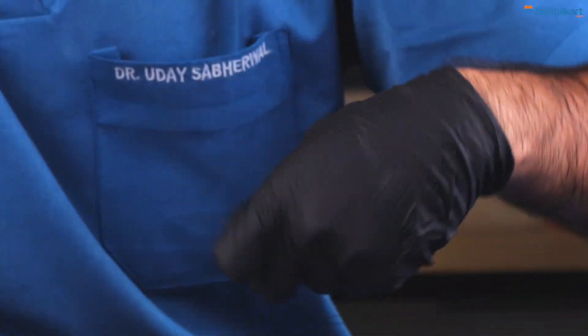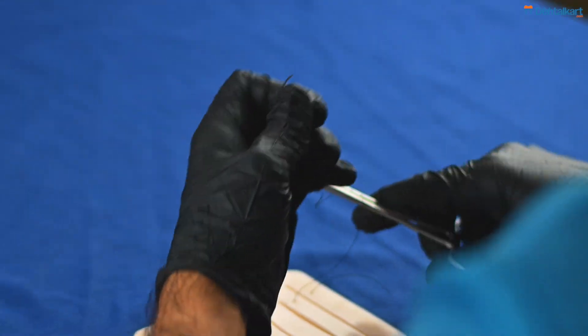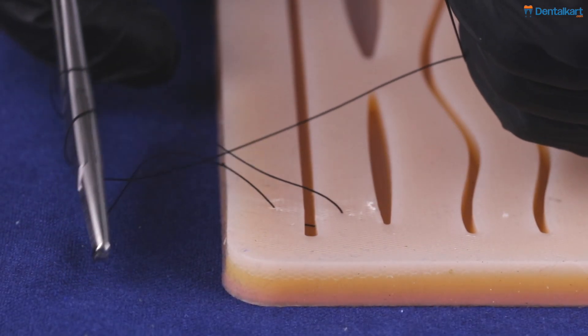In the next step we will be using the needle, stabilizing it with the non-working hand and wrapping it in the third and fourth fingers. For the knotting, we have used two clockwise, one anti-clockwise, and one clockwise knot.